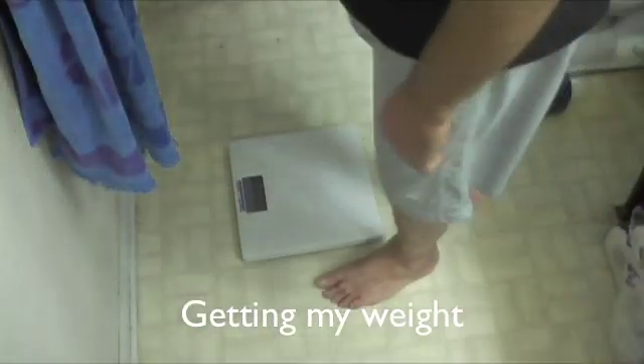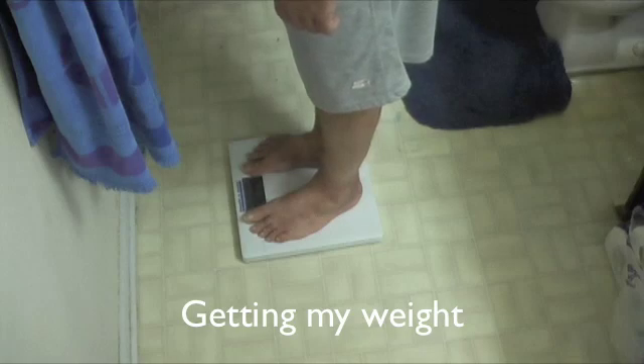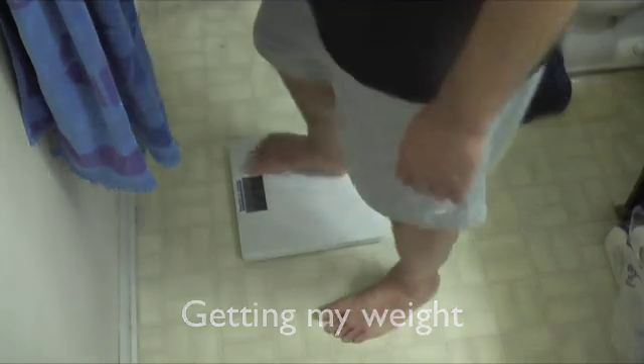Next I'm going to take my weight. The weight also helps determine the strength of the peritoneal dialysis fluid — whether you've gained a lot of fluid weight will help determine what solution you use.